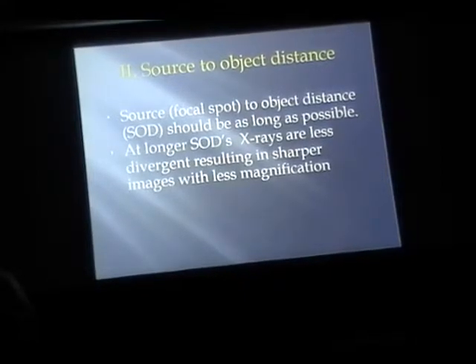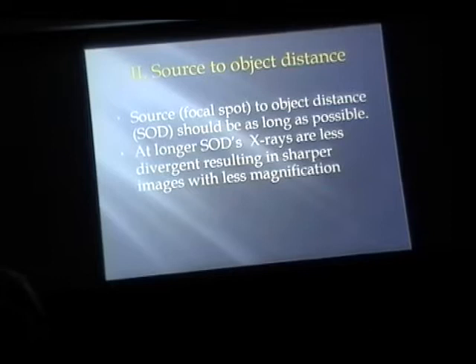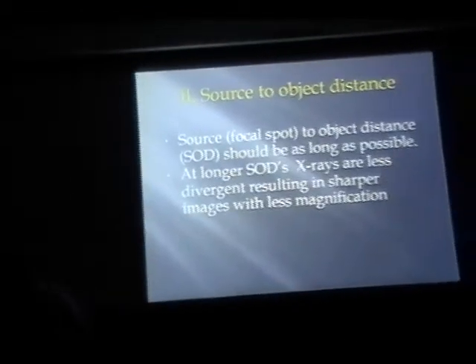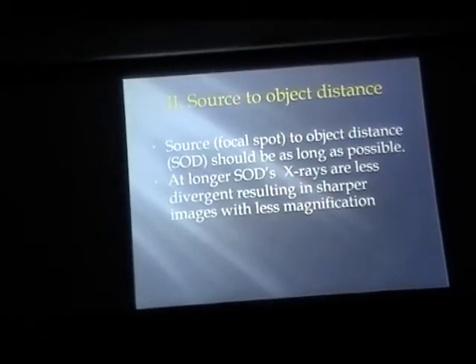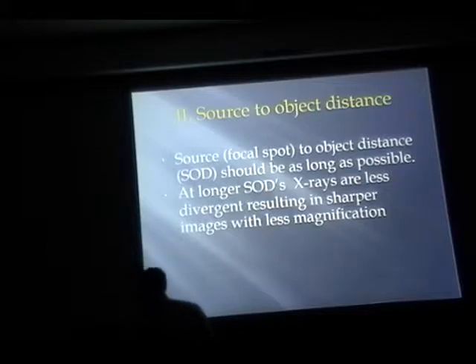What is going to happen if it's too close, shorter? I believe you expose the patient to the rays. Yes, okay. You also get more magnification if it was too close. Basically you'll get a lot of scatter because you don't want the unnecessary tissues to be exposed, right?